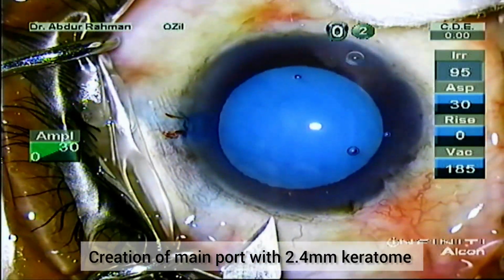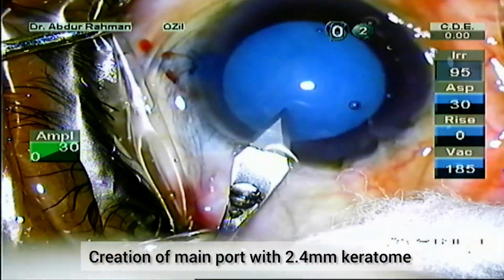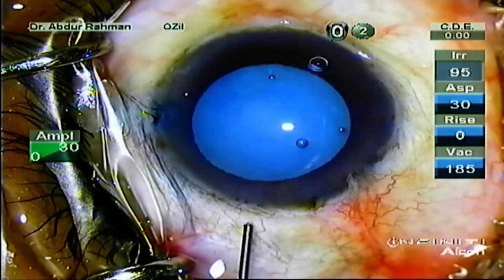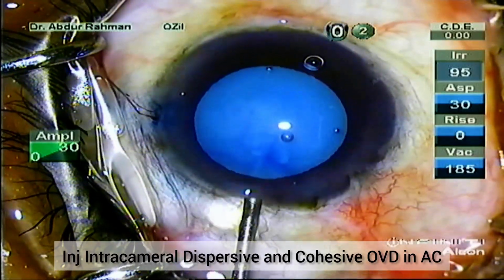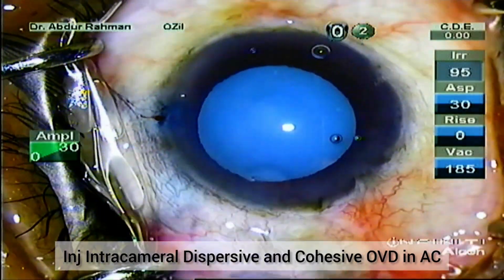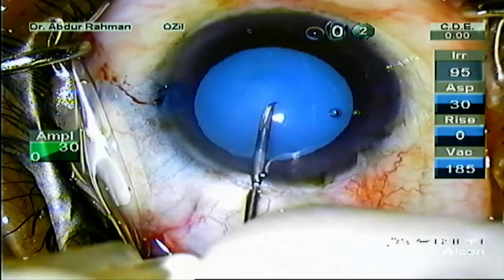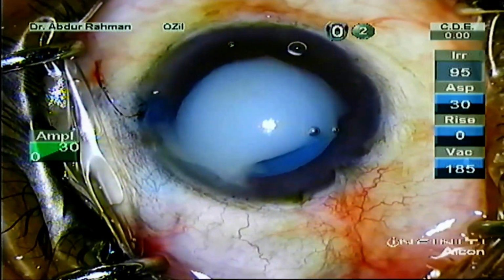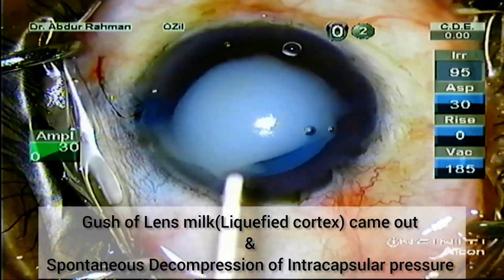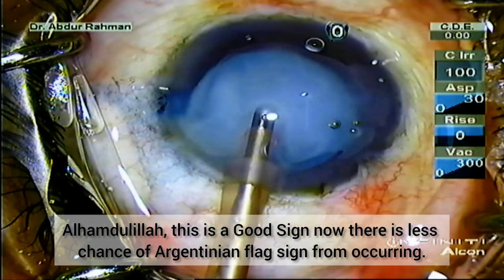Now with the help of a cotton bud, stabilize the eye and make the main port with a 2.4 mm keratome. Again refill the anterior chamber with OVD. Now with the help of a bent cystotome, raise up a flap, and a gush of fluid of liquefied cortex came out, spontaneously decompressing the capsular bag.